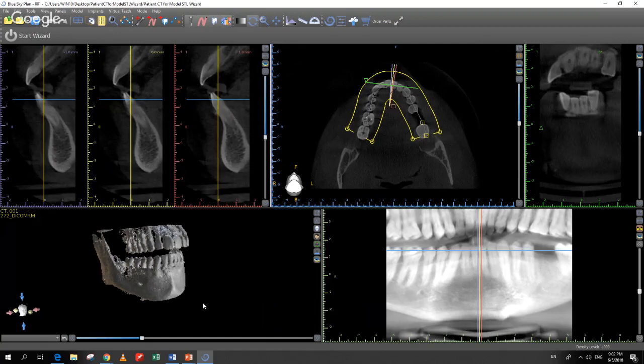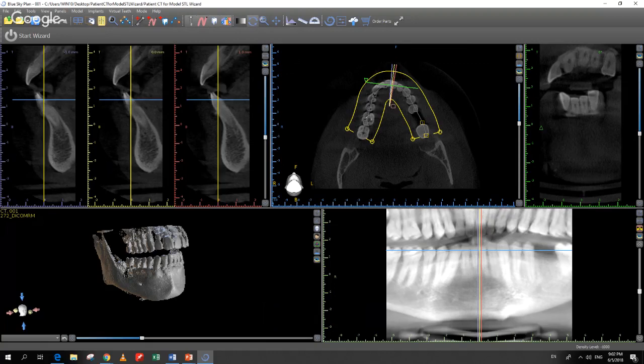The process that used to take weeks — sending out DICOMs, proprietary conversion, waiting for return — we just did in around a minute. Now we have the software open with our different views and our CT scan loaded.